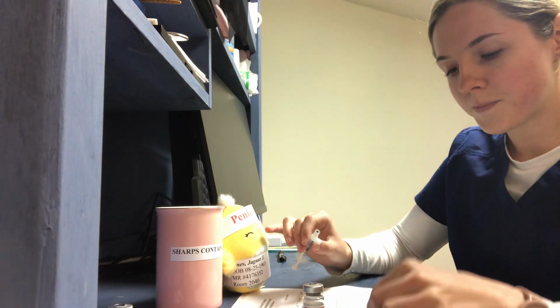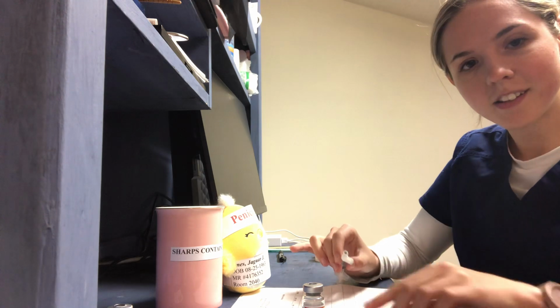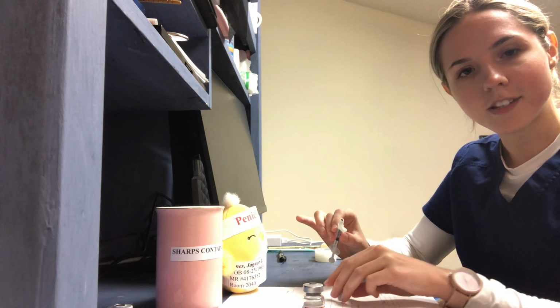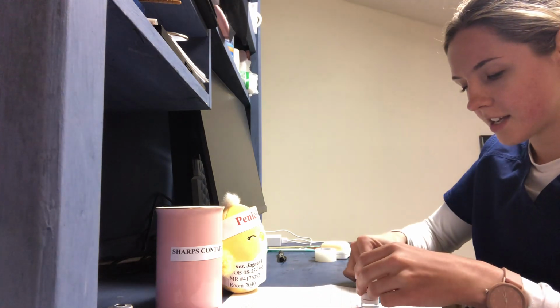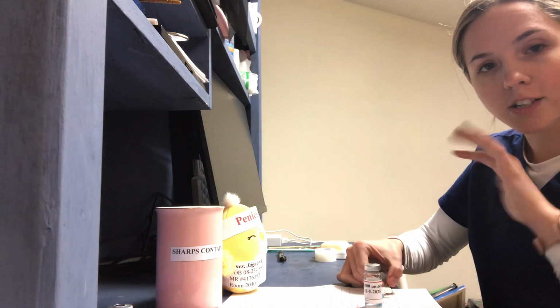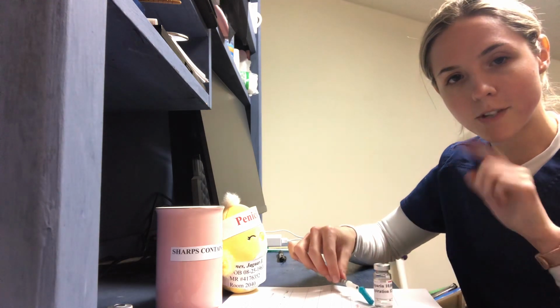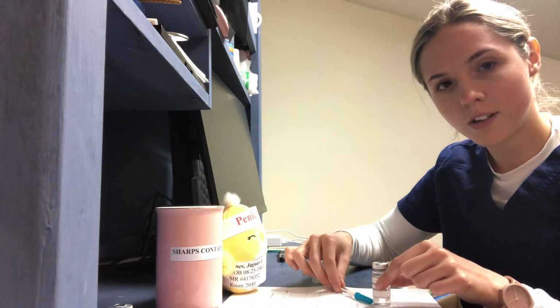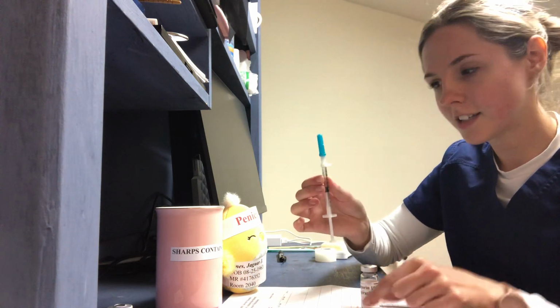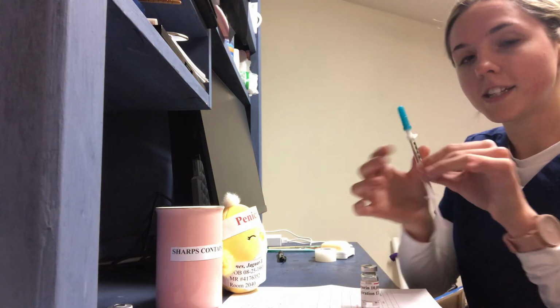I'm going to scoop, sorry, here, I'll put it over here so you can see what I'm doing. I'm going to scoop the needle back in to recap it. I'm not actually touching it, so what I'm doing is I'm using the vial to actually re-scoop this needle so that I don't actually have to touch anything. Now that it's on, secure it, everything is good.